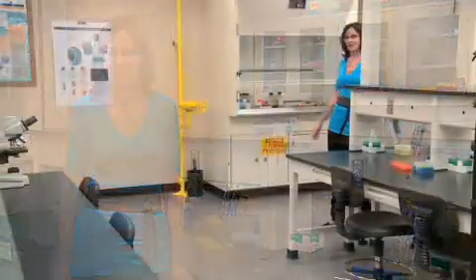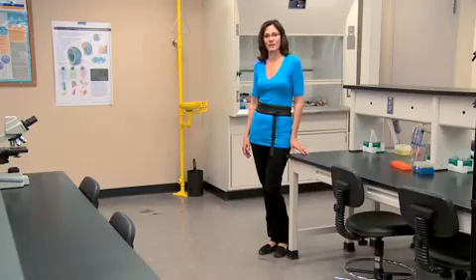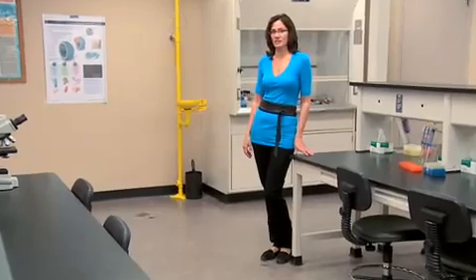Welcome to my lab, my home away from home, the place where I can transmit my passion for science to university students. In this room, I teach the classical subject of mammalian histology to pre-medical and pre-veterinary students in the Department of Cell and Developmental Biology. While I adore histology, I really look forward to teaching my course to bioengineering students about the cutting-edge techniques of cell culture and the concepts of tissue engineering.